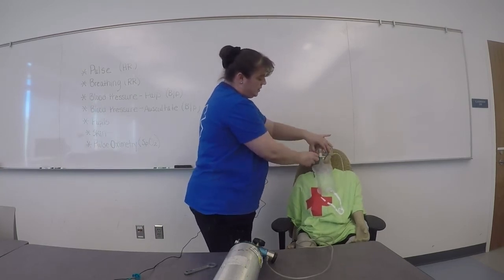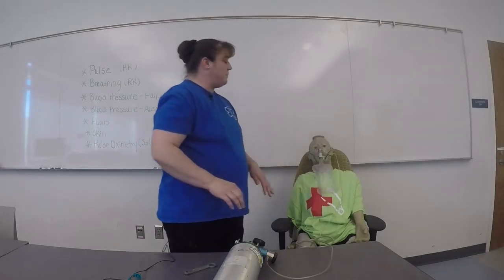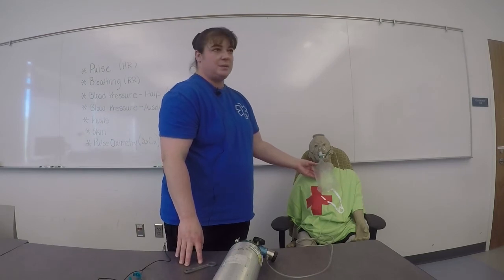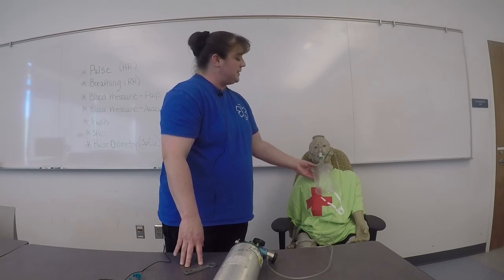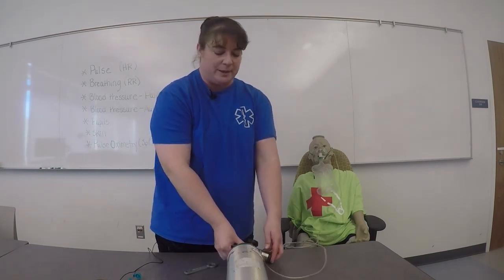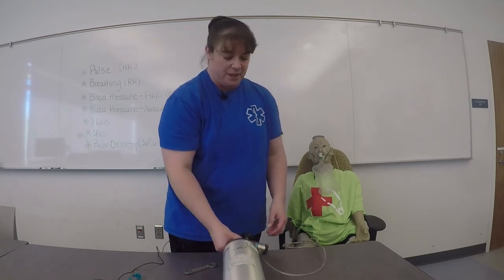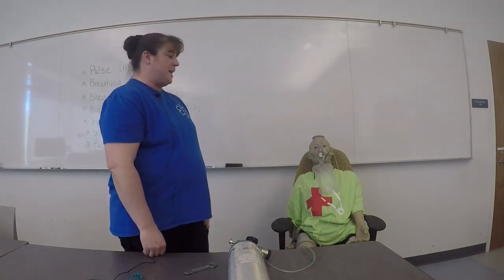I will tighten for a good fit and adjust the nose piece. The patient may then breathe through the mouth, nose, or mouth and nose. I'll watch the bag — every time the patient takes a breath, the bag should be at least one-third full. If the patient is not breathing very much and the bag remains full with each breath, I can back down to 12 liters per minute, but I do not want to drop below 10 liters per minute. If on 10 or 12 liters per minute the patient is emptying the bag each time, I will make sure I'm back up to 15 liters per minute. And I'm done with the station.